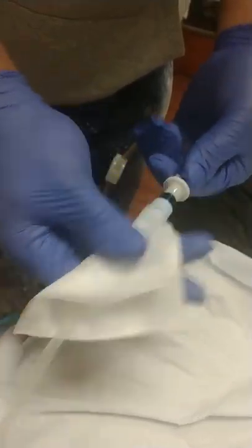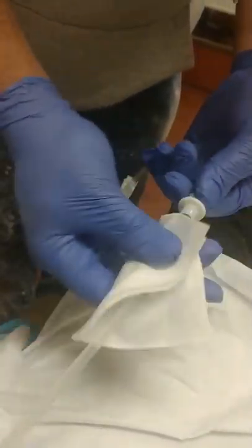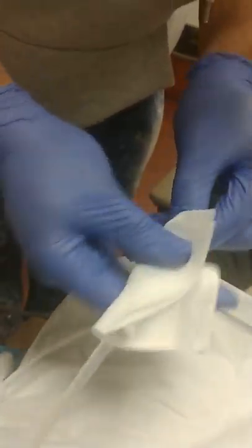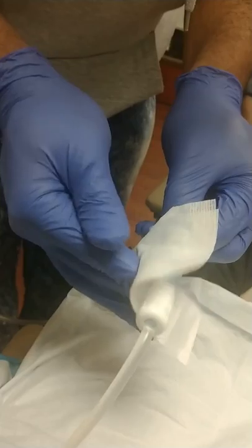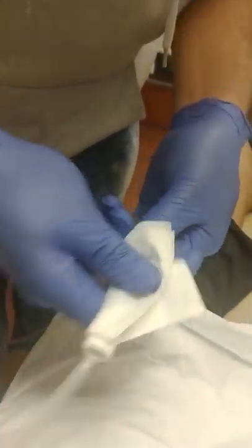He's already charted down how long I was on the machine and how much fluid it took off for me. Today it took off like a liter of fluid. And last Friday, it took 2 liters off. So I have a lot of fluid on me, you guys. This is something.